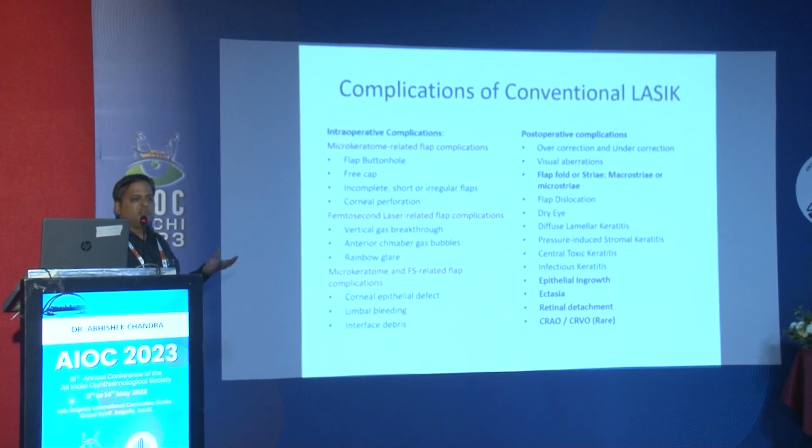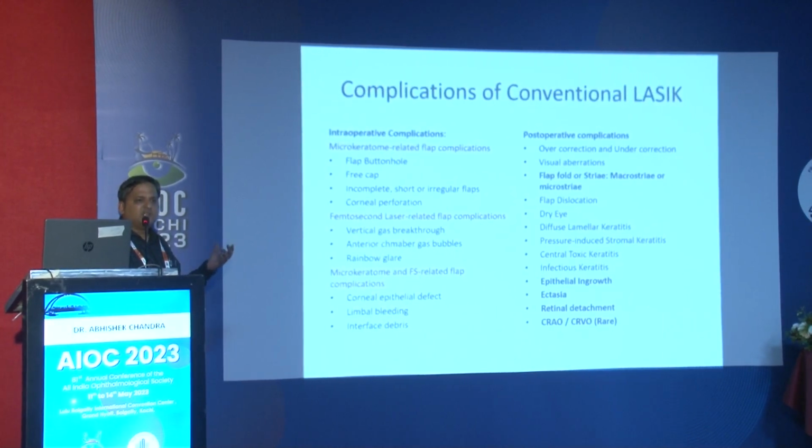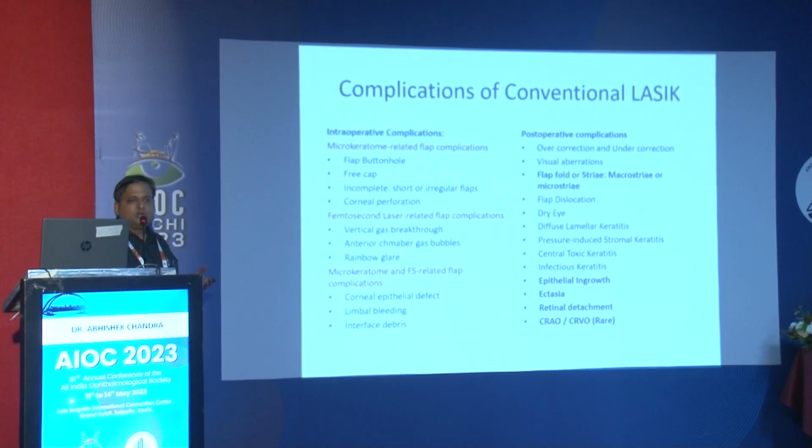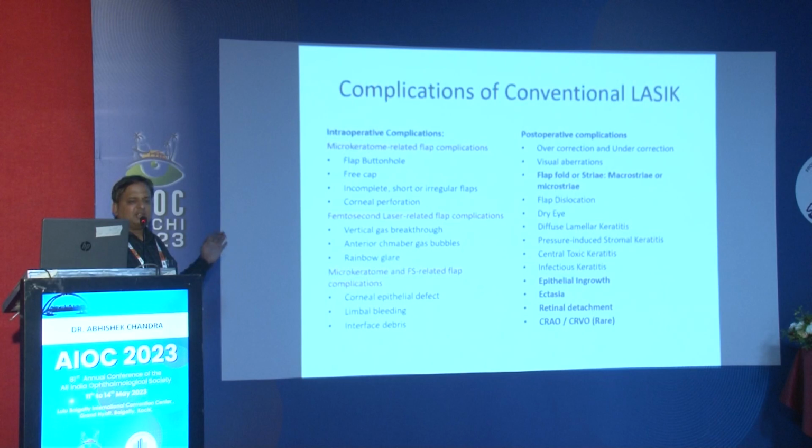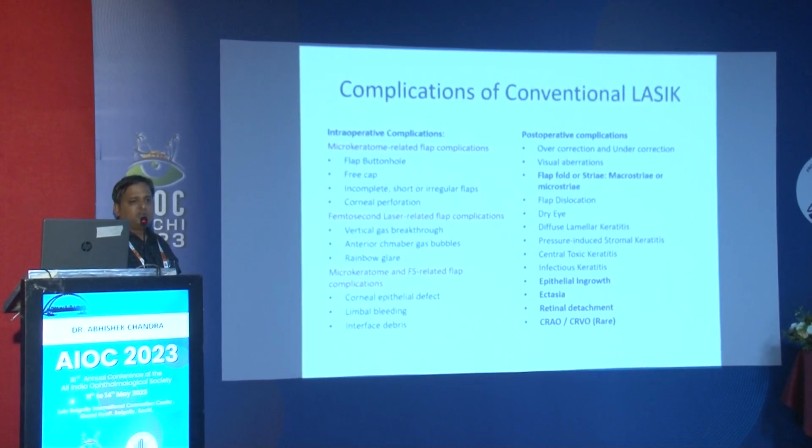So one is, if you have missed the holes or tears in the periphery preoperatively, then you are more prone to that. And second thing, when you are using a microkeratome, for making the cornea tight, you have to increase the pressure very high, and then you suddenly decompress it. So sometimes, due to this increase and decrease in the pressure, there is a PVD induction, which can then lead to a hole. Sometimes in very rare conditions, it has been reported that this procedure has led to CRAO and CRVO with complete loss of vision.